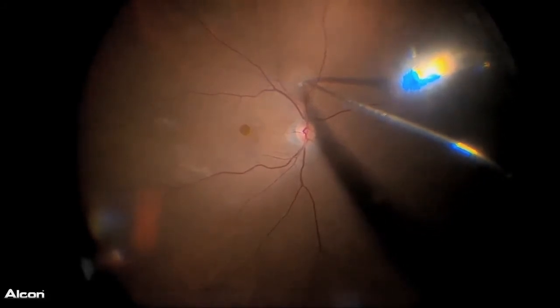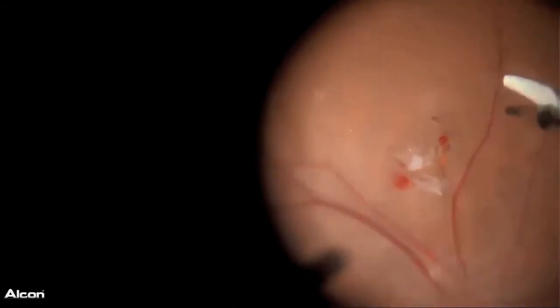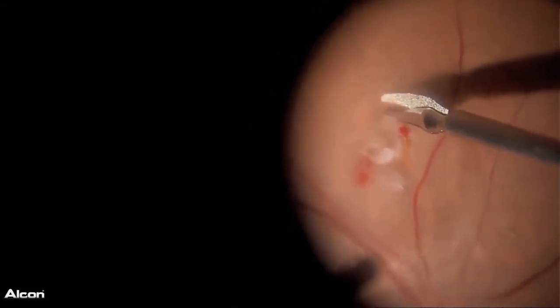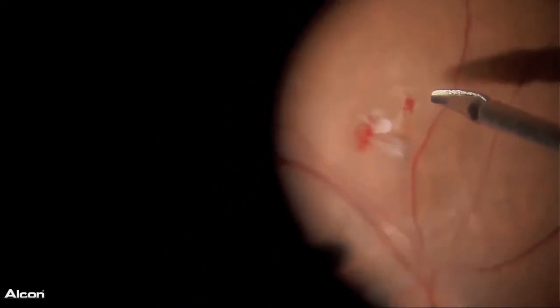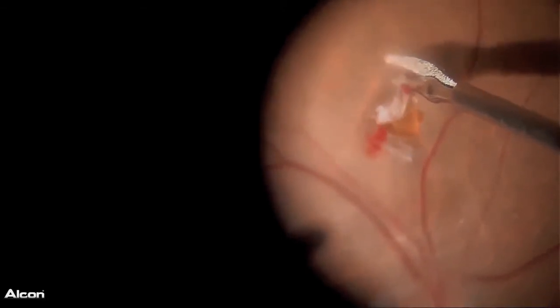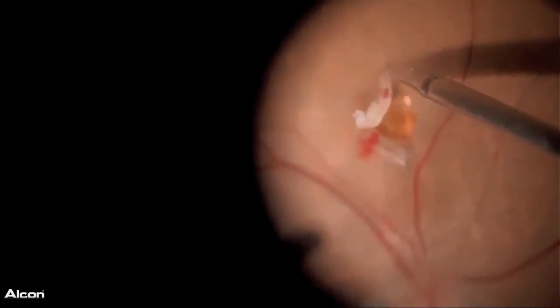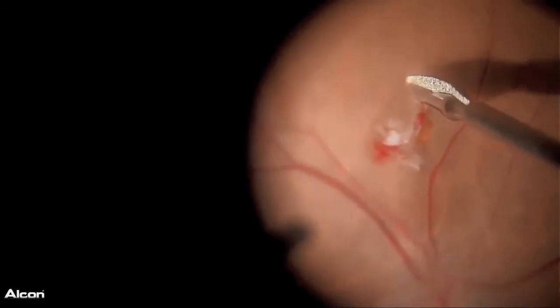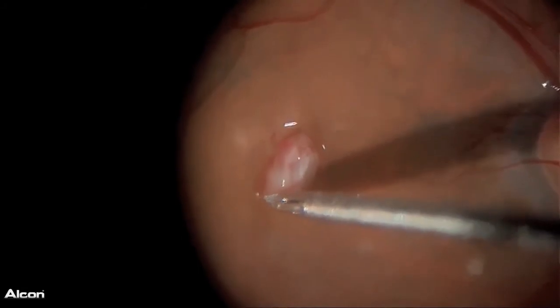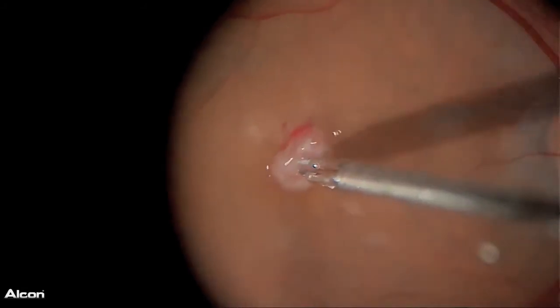This is the next case. The eye has a large macular hole with a standard axial length. It's much easier to perform autologous central retinal transplantation. The size of this large macular hole is about 1,221 micrometers. It's almost difficult to treat by the conventional surgical procedure.